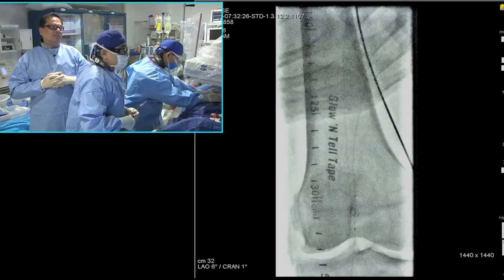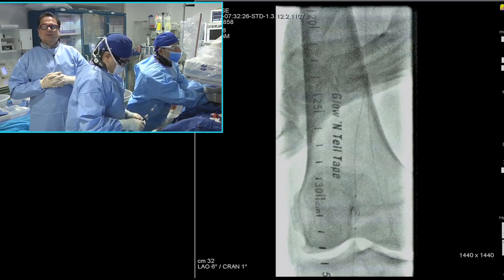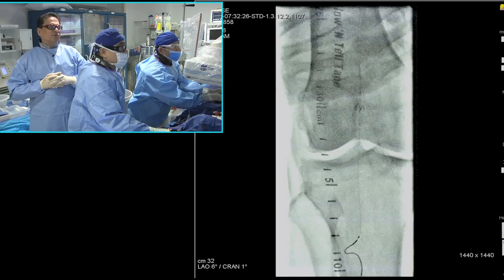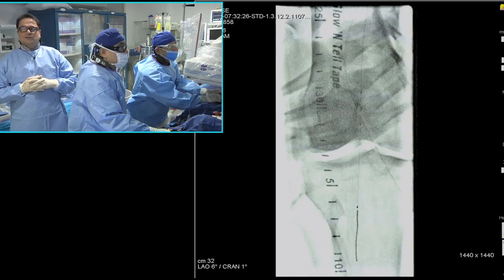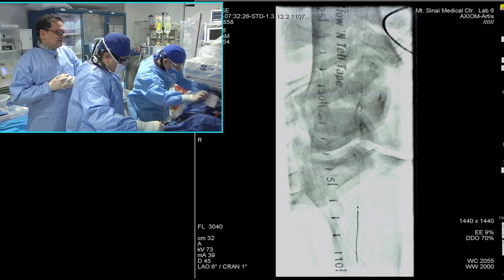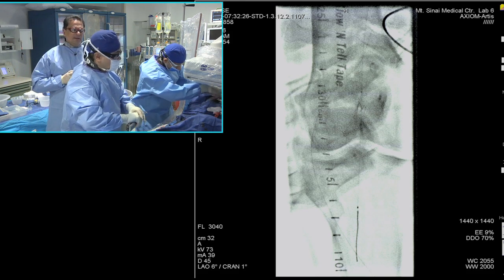Guys, watch the distal wire because he has occluded vessels below. So now you can see with this wire, you can see it's free moving. So you really have to watch the distal wire with this Abbott filter. Now we're walking it out, and now we're going to do a DSA picture, guys.